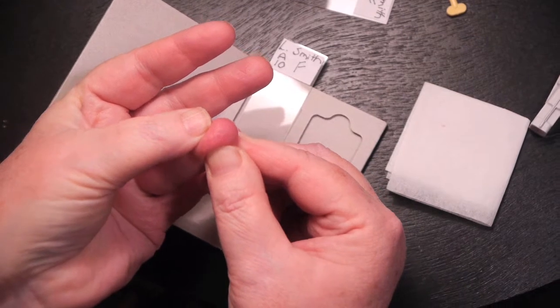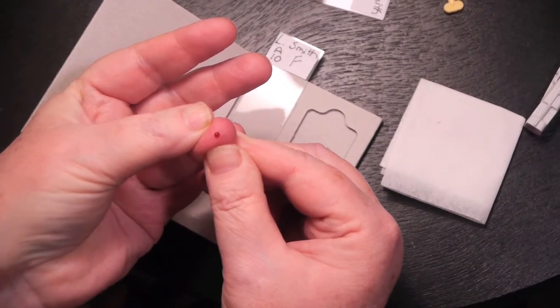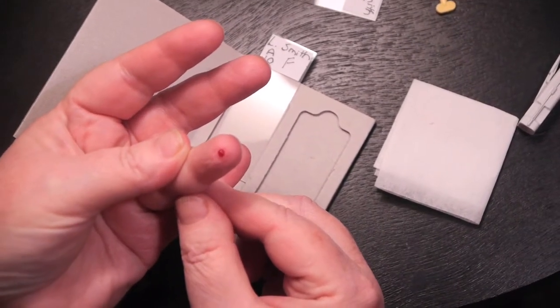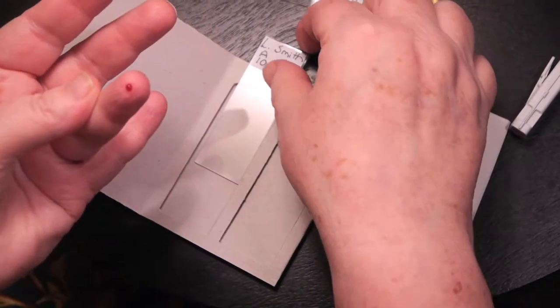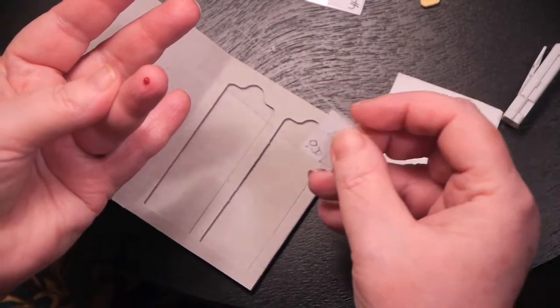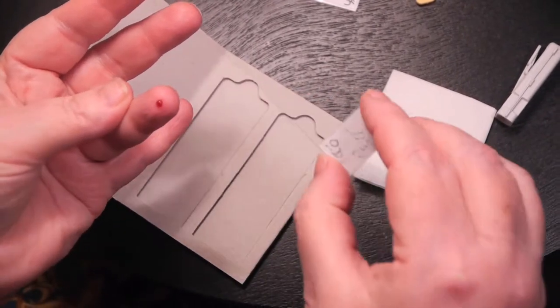Squeeze up a little more blood - all you need is a small drop like this. Take the second slide face down and create another line of drops along the slide.